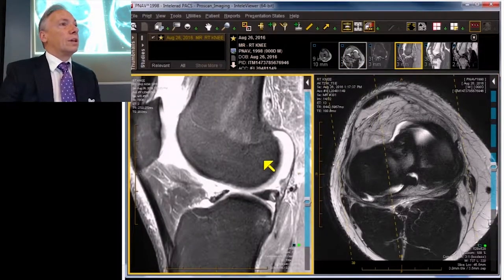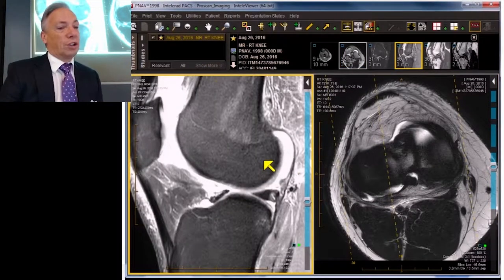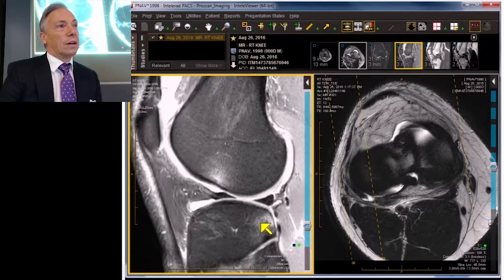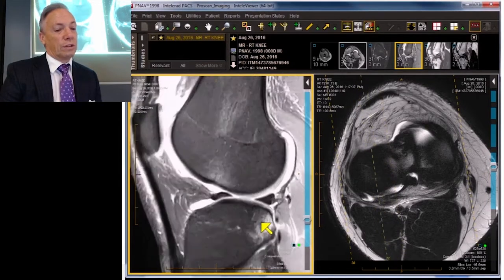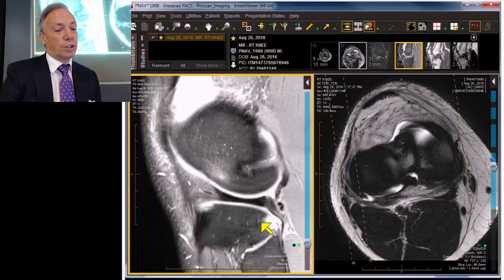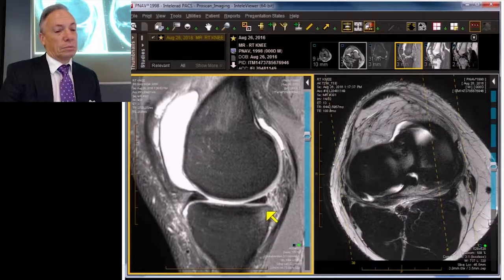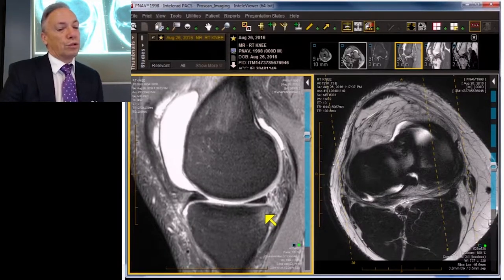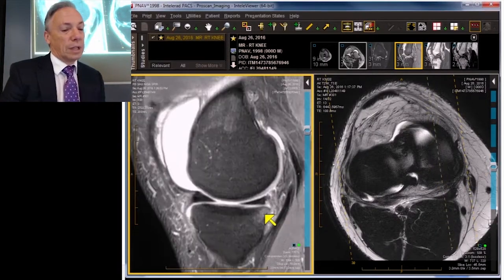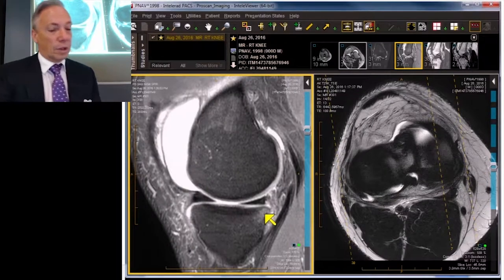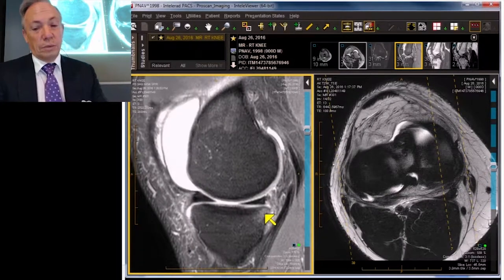Let's go to the sagittal projection. We've already established there's a major pivot shift with an ACL tear. There's the typical pivot shift bone injury of the tibia as well as the femur, and you've got the same bone injury in the posterior medial tibia.